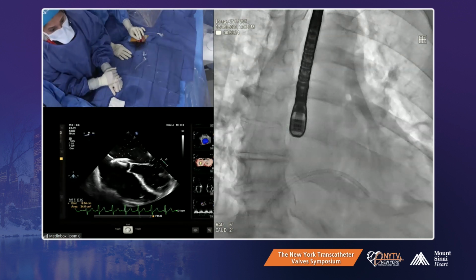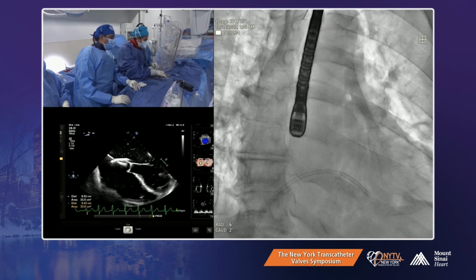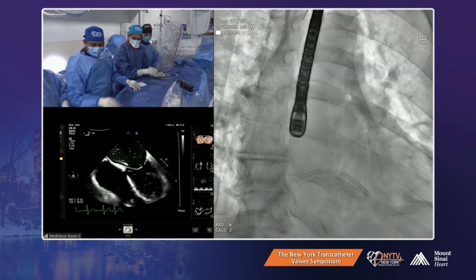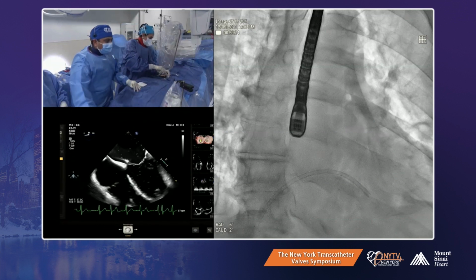Tell me, I understood. Okay, the pressure. Do we zero? Measure again for Dr. Carr. Yeah. 5.5. Heparin's given? Yep. Okay, so it'd be interesting if you get a chance to show us what the left atrial pressure and waveform looks like. Yeah, sure, we are going to do that.